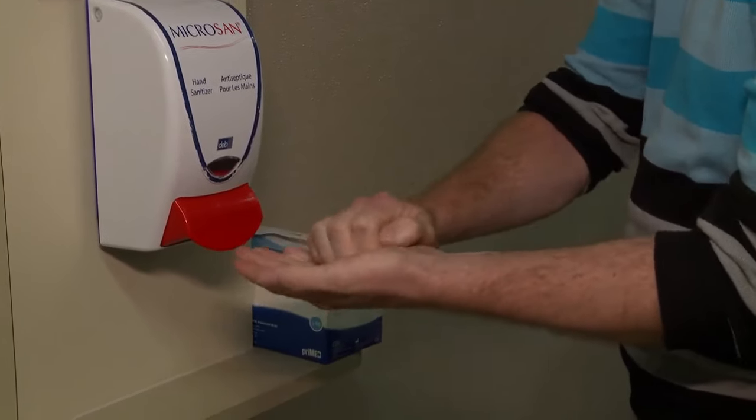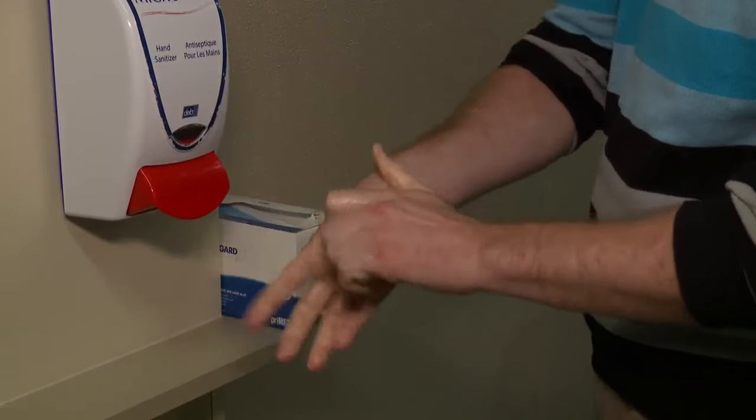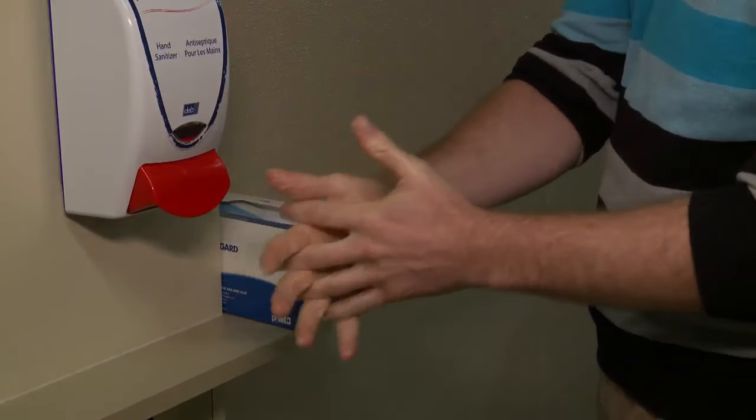First, clean your hands with soap and water or alcohol-based hand rub, making sure you cover all hand surfaces. Rub for at least 15 to 20 seconds.